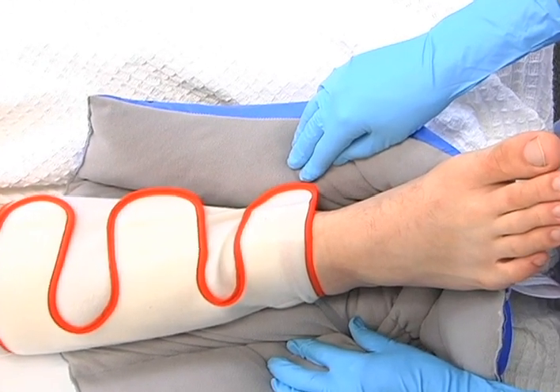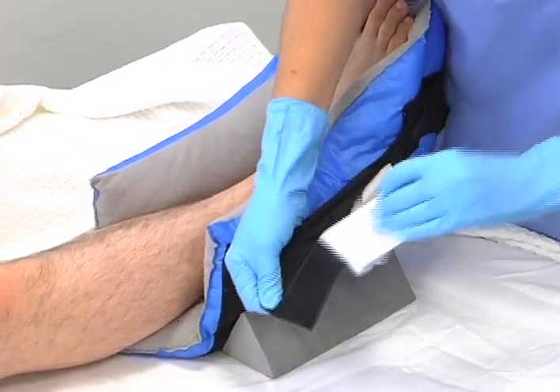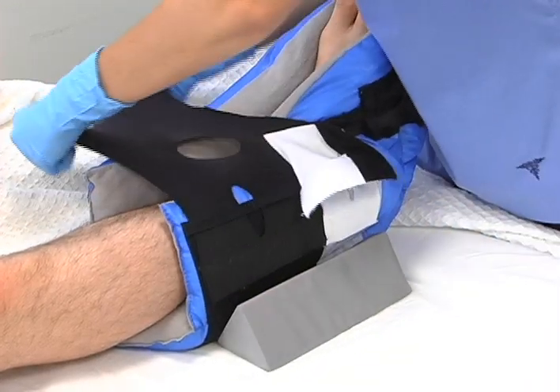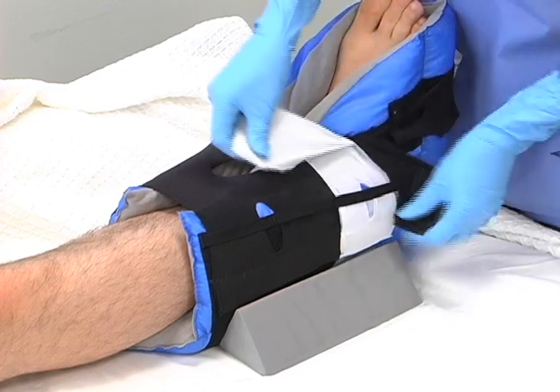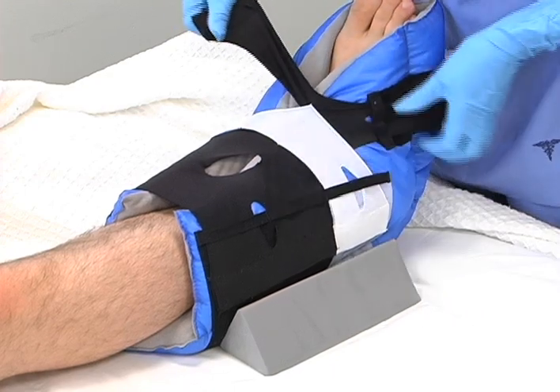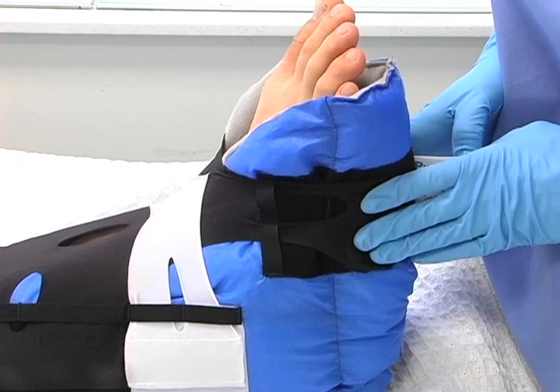Also, make sure it is positioned away from the skin. Now, you're ready to fasten the straps. Remove the fabric strip that's over the fasteners on the stretch panels and throw it away. Attach the wide black stretch panel covering the shin. Next, attach the white stretch panel covering the ankle. Then attach the black contracture strap across the front of the foot. This strap supports the upright position of the foot and helps prevent plantar flexion contracture.